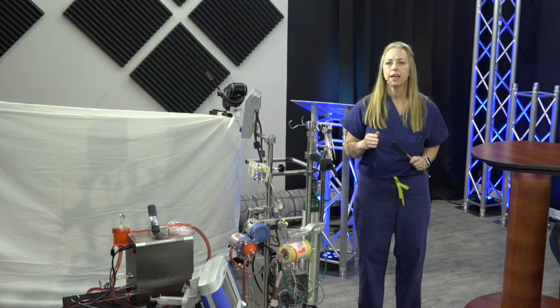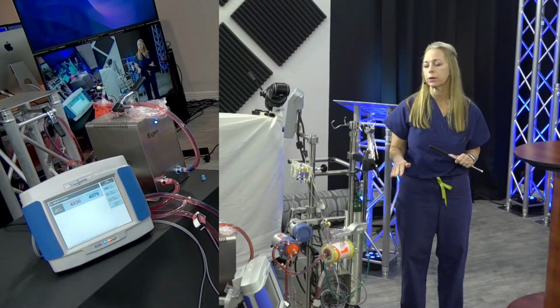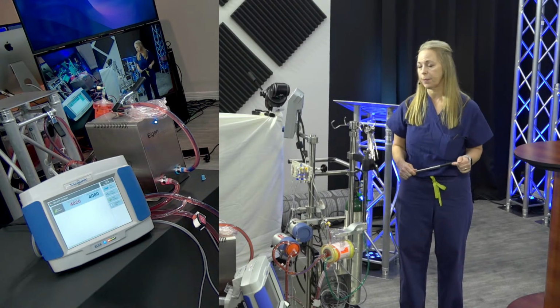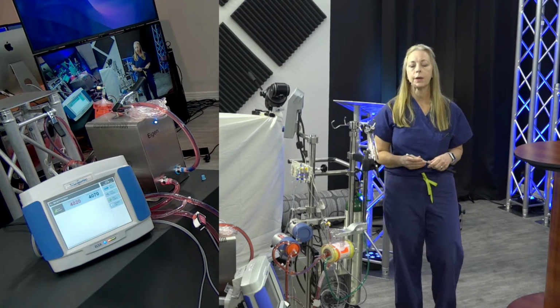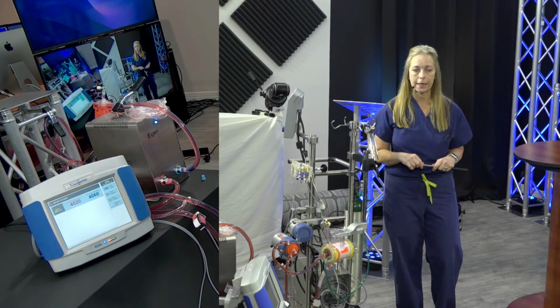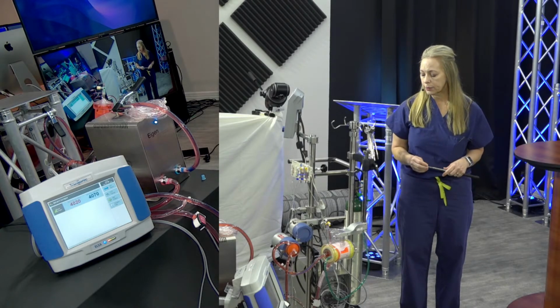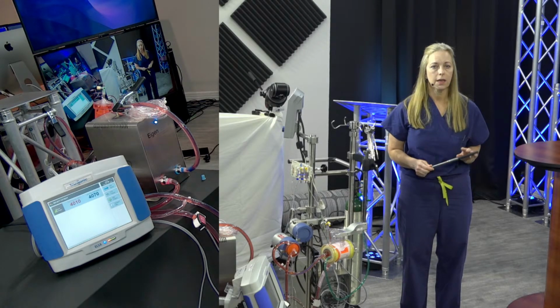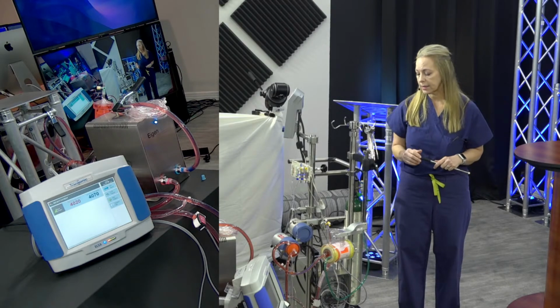Now, it's at 170, 175. Okay, fine. Now, you're testing this, let's say, every day or every couple days, or maybe you don't even have the device on there, but you're starting to get concerned about this specific patient and this oxygenator. Is it getting close to time that we want to go ahead and change the oxygenator? You can hook up the ELSA meter at any time. Go ahead and run your test, and then you're able to see, oh, my oxygenator volume is down to 150. That's a pretty substantial drop from the last time that I checked it. We've got some clot in there.